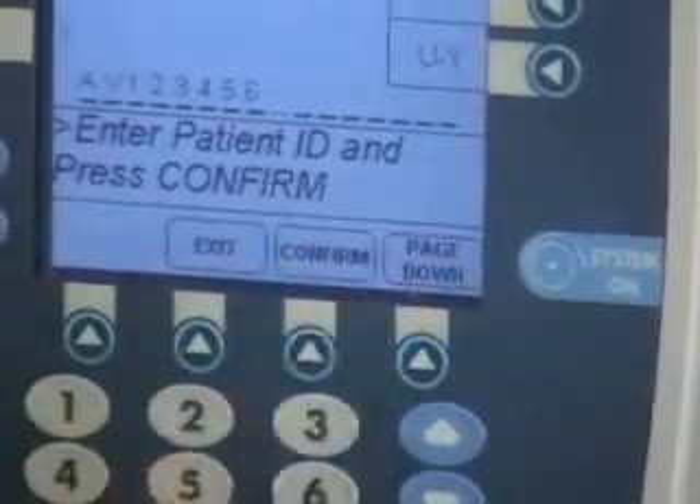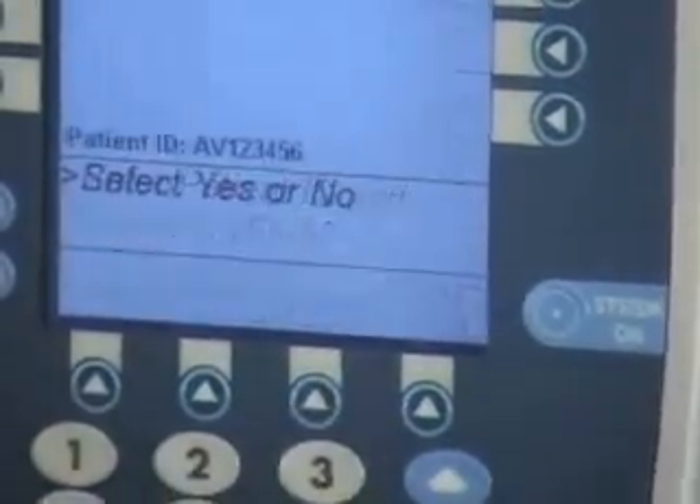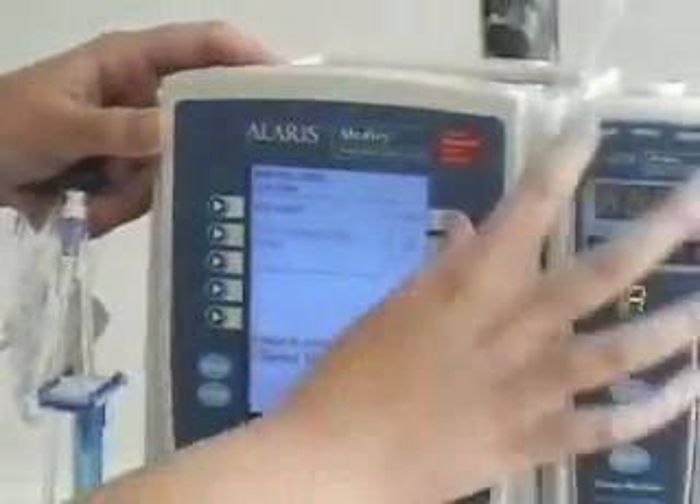I have an option to exit, confirm, or page down — so we'll confirm. Then it asks you: is this critical care? We will say yes.